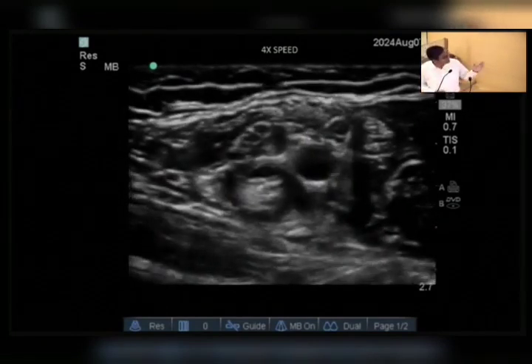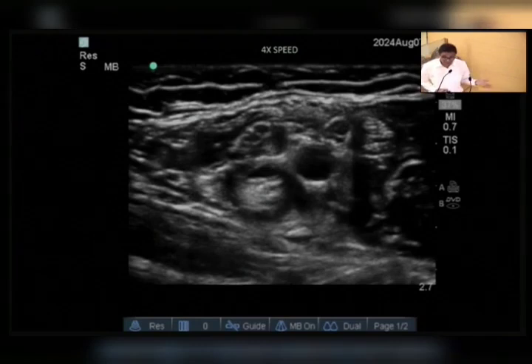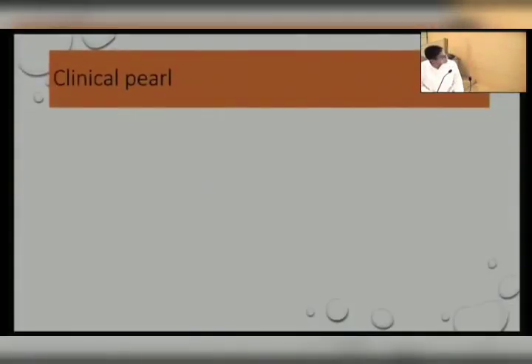So after the block I generally scan, and again I trace back, and I found that each nerve is surrounded by local anesthetic in a good manner, and thereby we can assure the success rate. Let's see some clinical pearls.